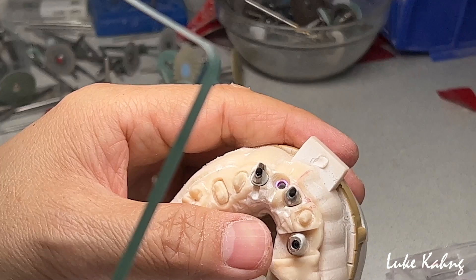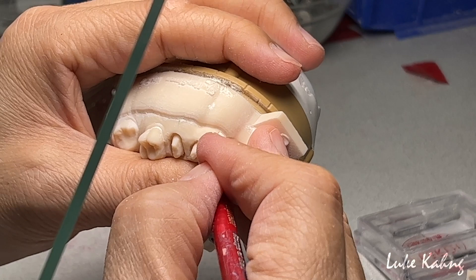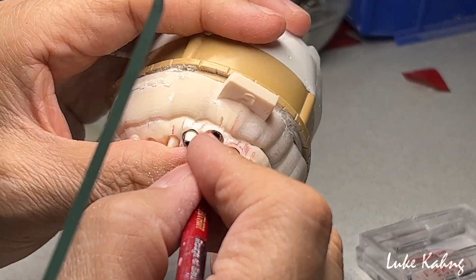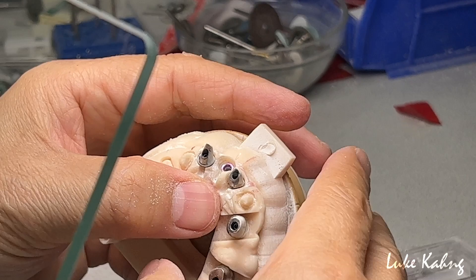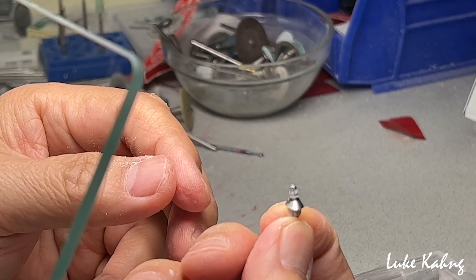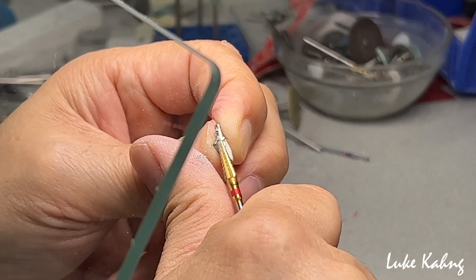Other issues here are a problem — I do not like this. In order to make the 3-unit, I don't have any room. Same thing — natural teeth, don't want to engage this. No matter who designed it, this design was really fat for the interior contour. The design itself is beautiful — Atlantis abutment line — but unfortunately I have to trim it a lot. Then I can be creative.